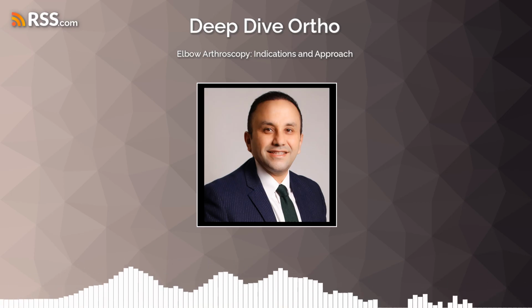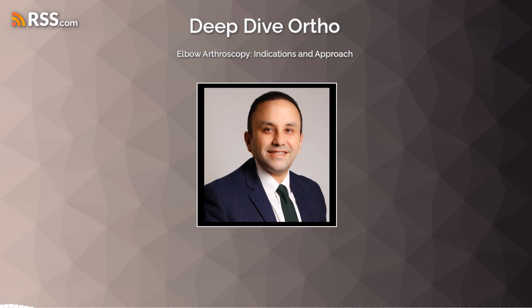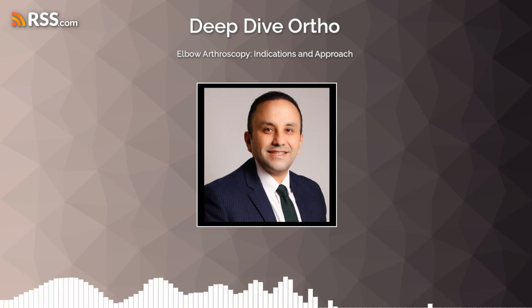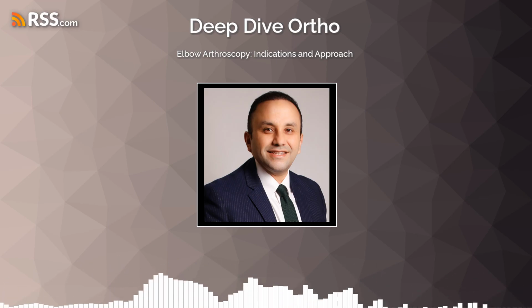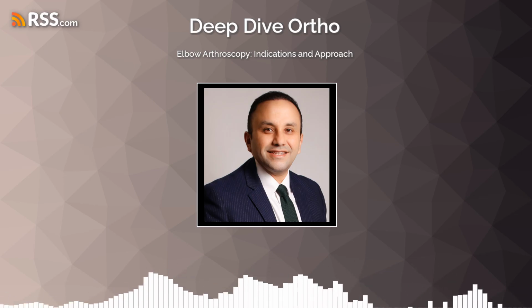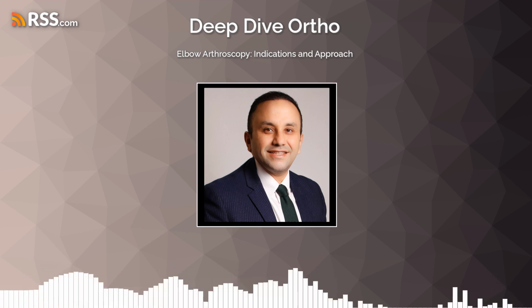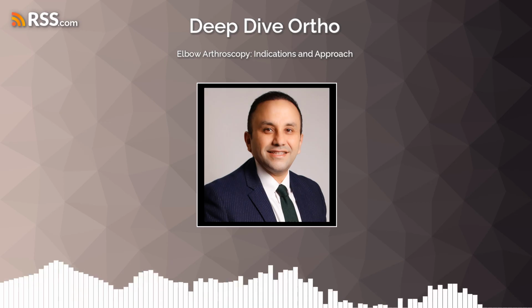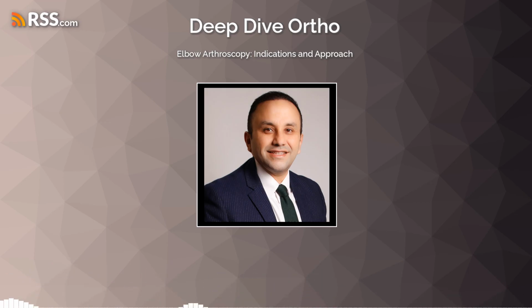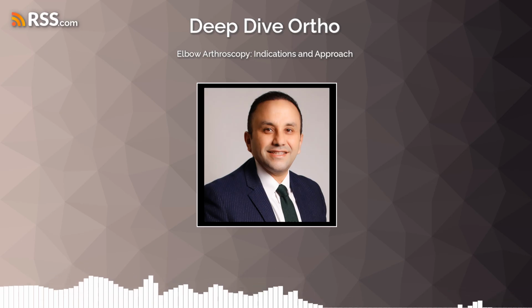Some surgeons also prefer to avoid regional blocks so they can accurately assess nerve function immediately after the surgery, without any lingering effects from the block that might confound their assessment. That makes sense, wanting that clear neurological picture post-op. Exactly. Beyond positioning and anesthesia, there are several foundational preoperative principles that are absolutely essential for a safe and successful procedure. Firstly, we meticulously pad all bony prominences to prevent pressure injuries.